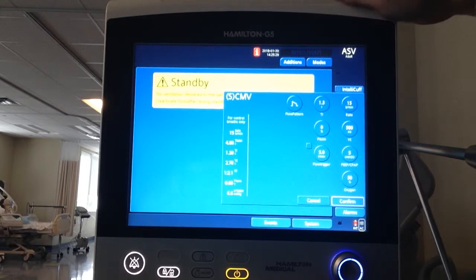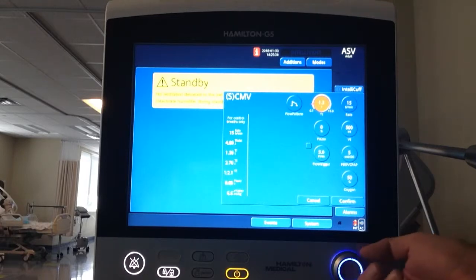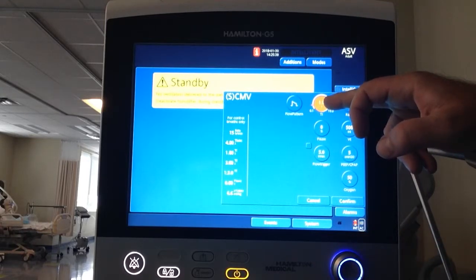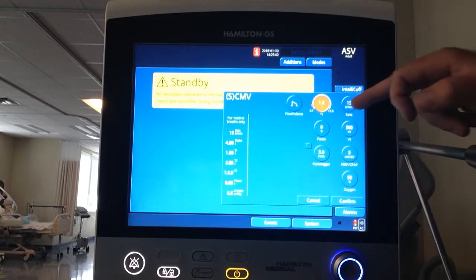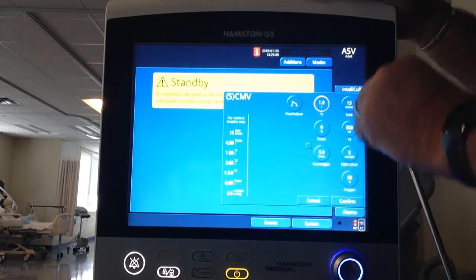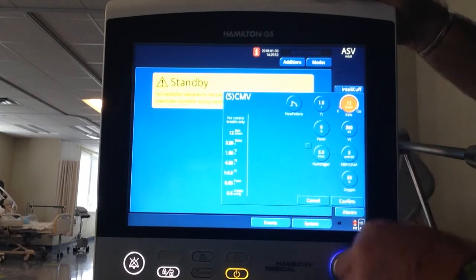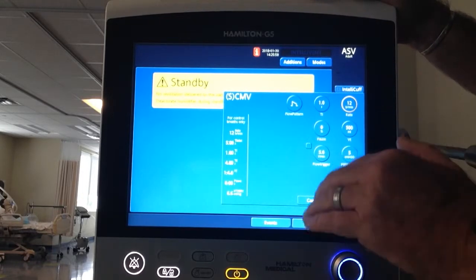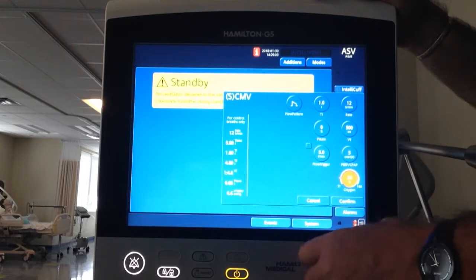This takes me into my settings. I want my inspiratory time - Ti - to be one second, right there. Now I want my rate, so I'll unselect Ti and come over here - I'm going to put my rate down to 12 and accept it with the knob. My tidal volume is 500, I'm happy with that. PEEP of 5, and I want to turn the oxygen down to 21 percent.